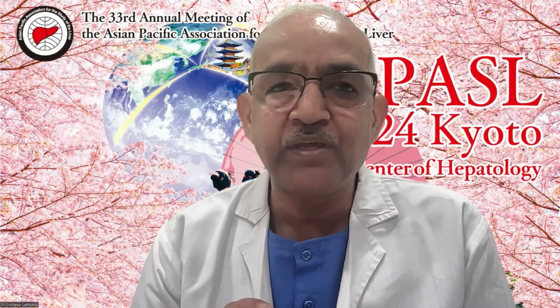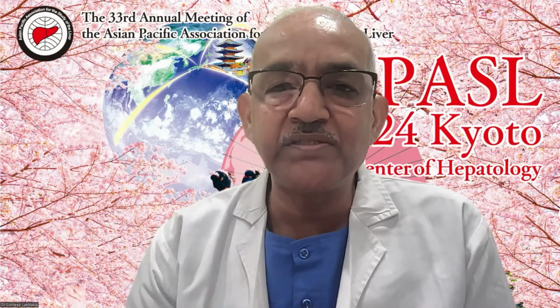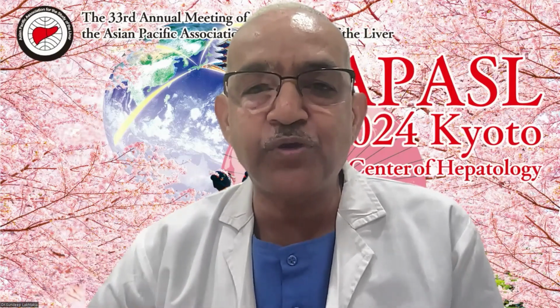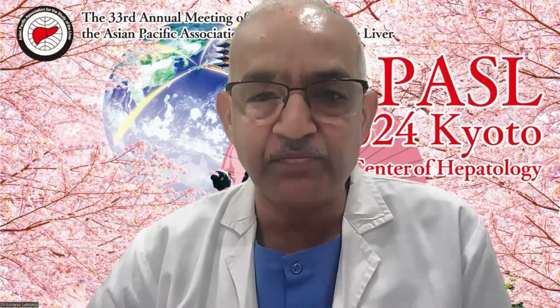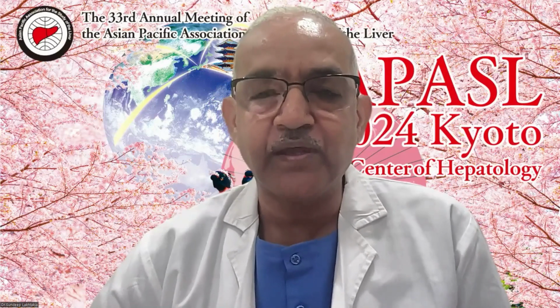They first block the shunt with a balloon and then go beyond and inject sclerosing agents in a liberal fashion. But if there are more exit points, then embolism still has a possibility. EUS has made it safer and simpler.